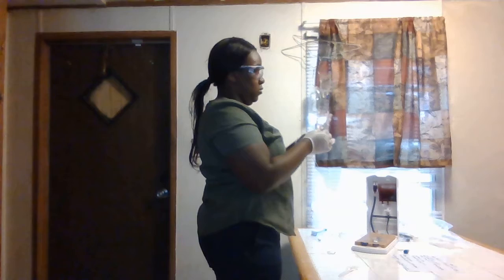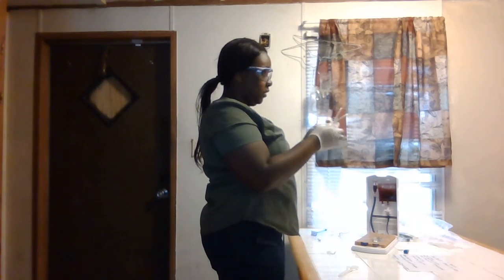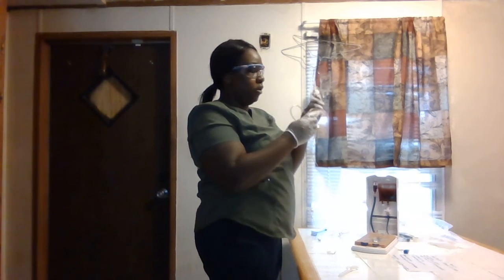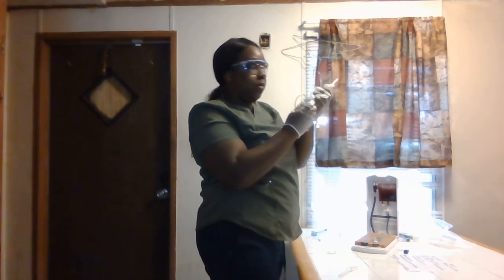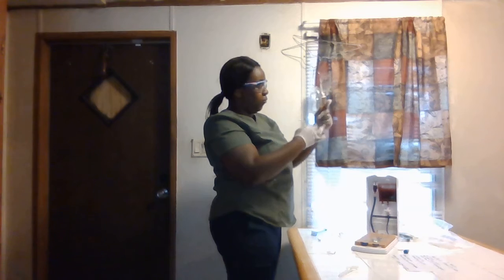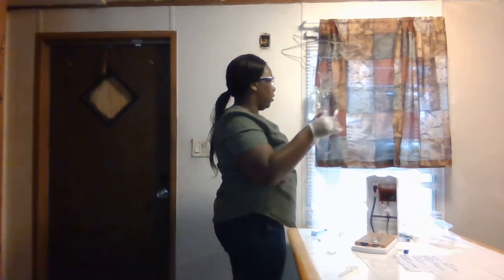Okay, again, with these spikes, we always want to maintain sterility, and also we want to make sure the roller clamp is clamped off. We don't want to waste a bunch of antibiotic and then have to call the pharmacy and tell them that we wasted it. So my clamp is off. And again, it's a short tube, and so after I spiked it and once I am ready to prime it, I always keep my hand on the roller clamp and never let it go.